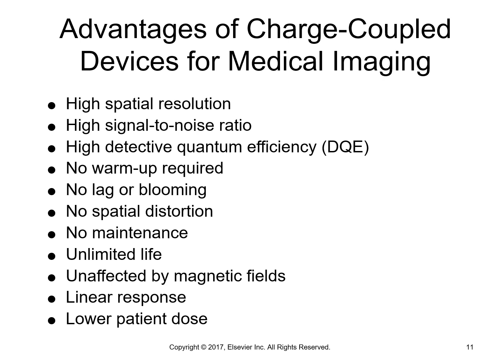So as the signal gets weaker, there is noise always, but your radio can ignore that because it's so weak. In the same way, a really efficient image receptor can ignore noise, or noise can be minimal if the signal is just ridiculously stronger than the noise. So a good signal to noise ratio is basically just good broadcasting.